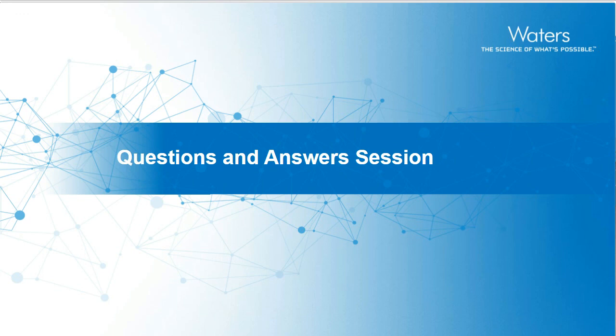Emily? So I've not actually added anything to the library of RADIAN, but when I spoke to my colleagues that have, they have said that it's very simple. It's through a third-party software called MSP Librarian, and we do have documents and support available if people did want that.